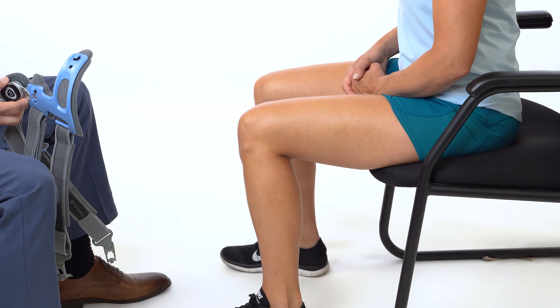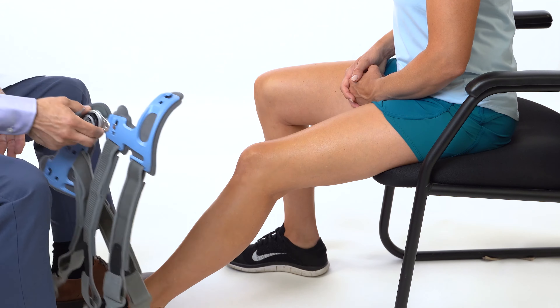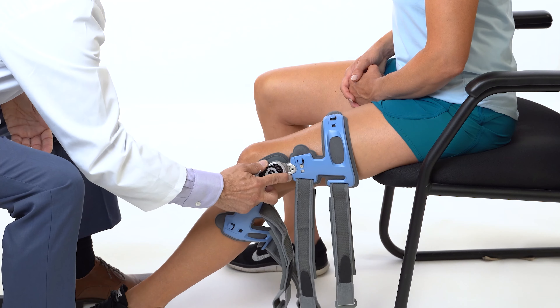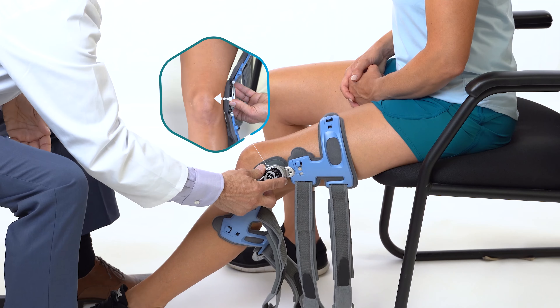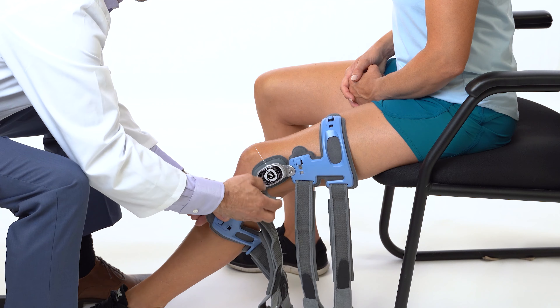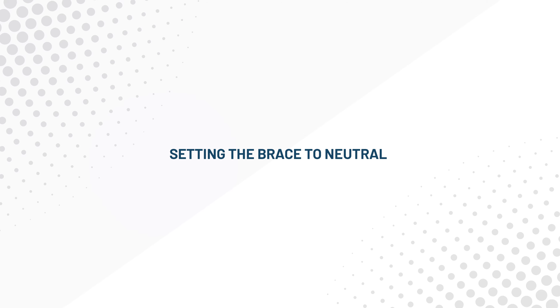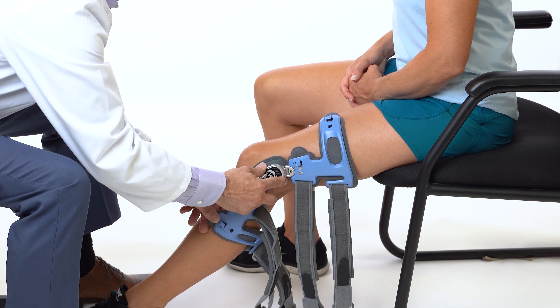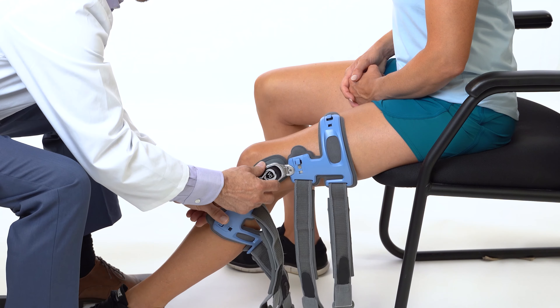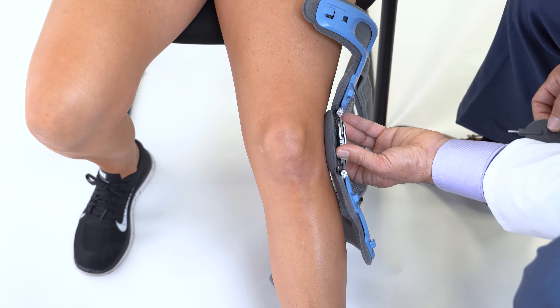While sitting at the edge of a chair, bend the knee slightly and apply the brace to the lateral, or outside, of the leg. Align the center of the hinge with the top of the kneecap and position it slightly behind the midline of the leg.